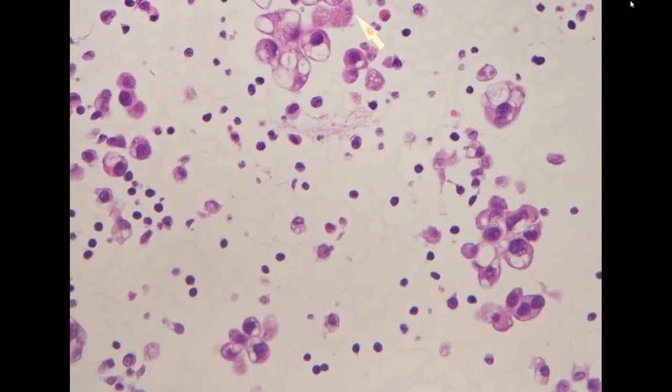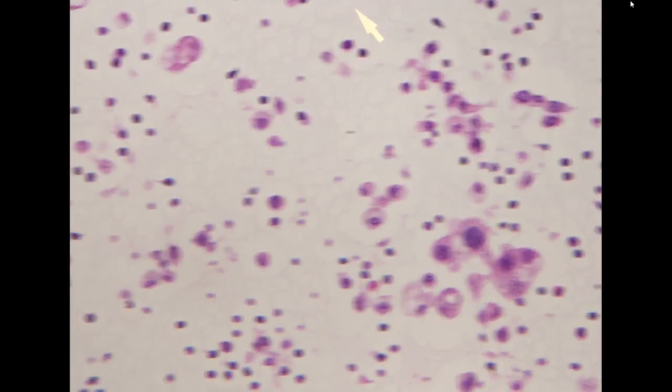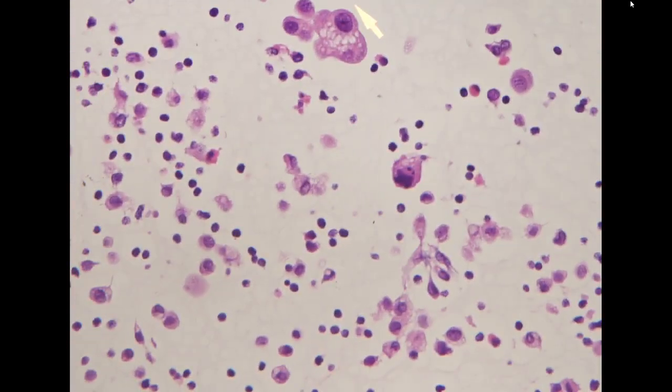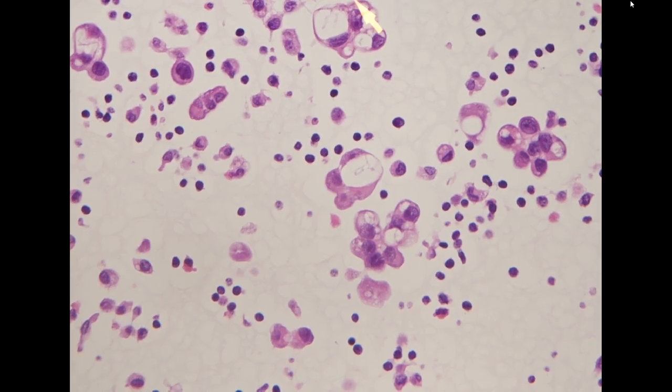So the patient may originally have had a mixed small cell and non-small cell carcinoma, but the pleura effusion initially presented with metastatic small cell carcinoma, and after the treatment regimen for small cell carcinoma, the non-small cell carcinoma came out. Okay, so this is kind of complicated, and we will need to further evaluate the specimen. The other situation is, I don't think we missed the specimen from the other patient, but yeah, this is the other possibility that we need to think about.